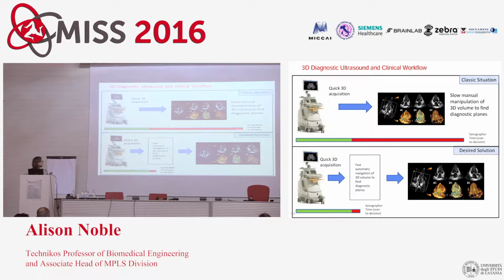But as with lots of introductions, the introduction then introduced its own problems. Particularly, with 3D ultrasound acquisition, the person you're trying to impress is the sonographer.